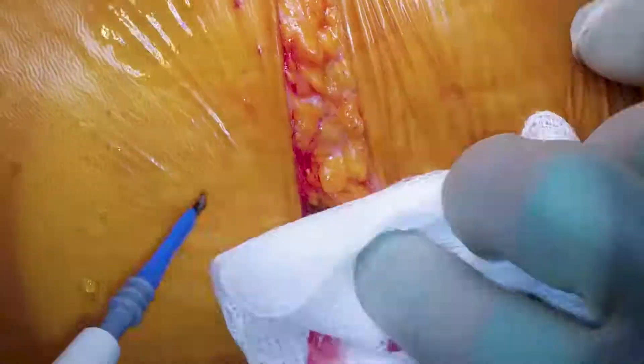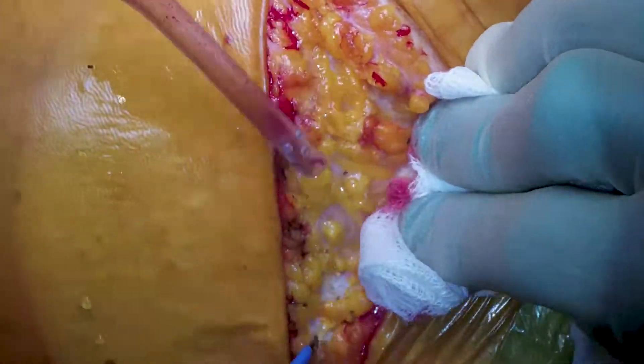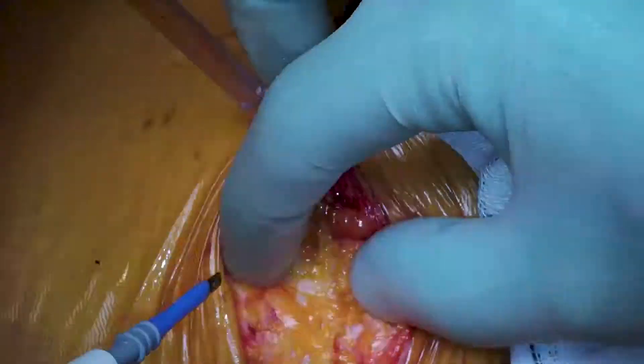The first part of the video covers the anterolateral thoracotomy which is going on here. What you want to do is find the fifth rib space. A good way to do this is to go down the inferior border of the scapula and make an incision a bit anterior to this.